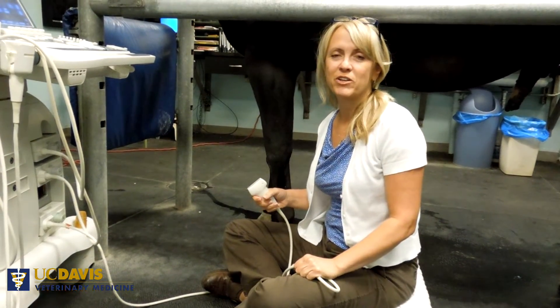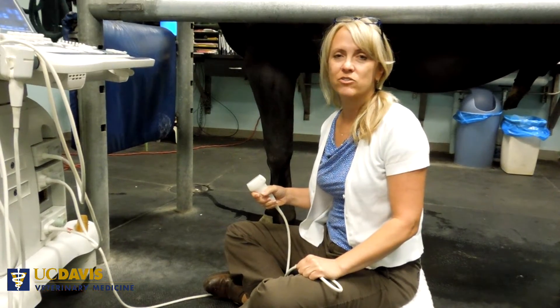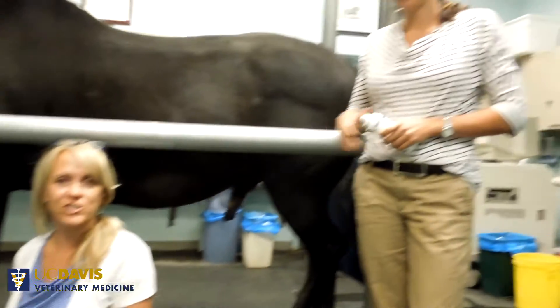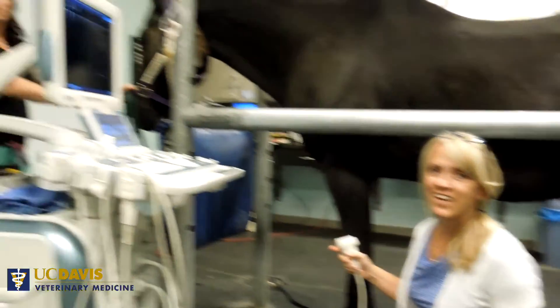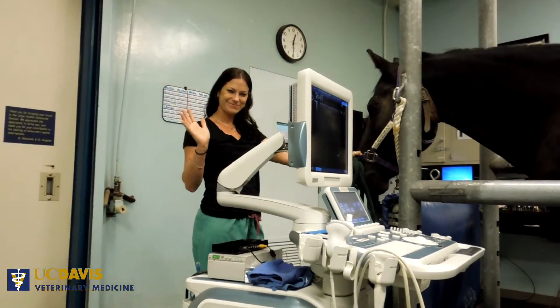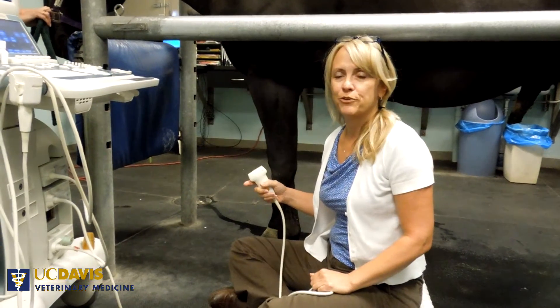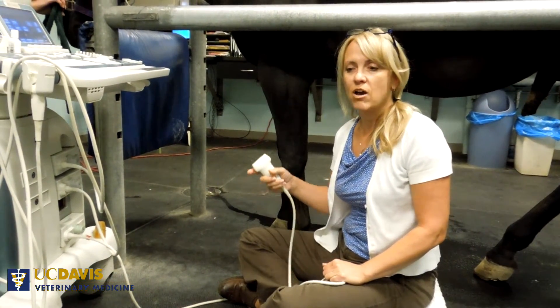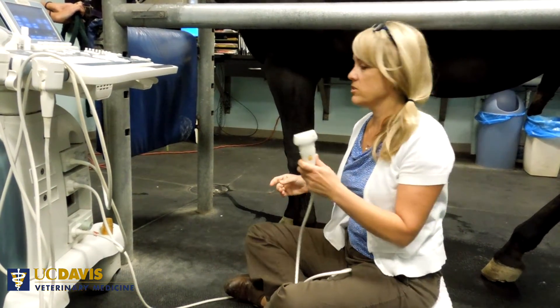My name is Dr. Marybeth Whitcomb, and I am the section head of the Large Animal Ultrasound Service at UC Davis. I'm joined here today with our ultrasound fellow, Dr. Georgette Shields, our ultrasound technician, Haley Robinson, and Dr. Vethi Vaughn, who's functioning as our videographer. I'm going to talk about how to hold the transducer when you're scanning palmar or plantar structures of the metacarpus or metatarsus.